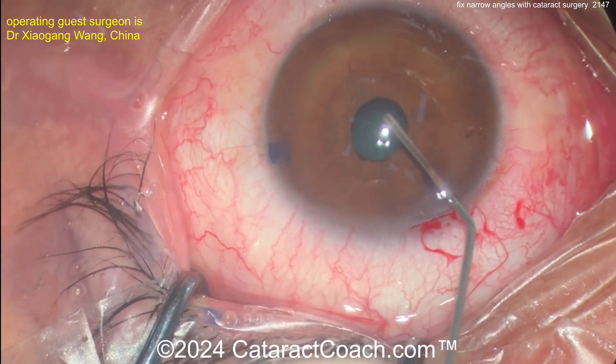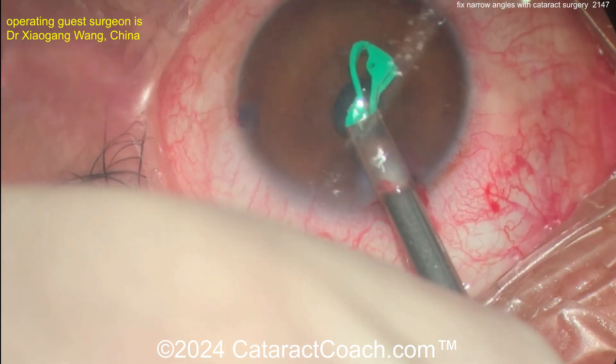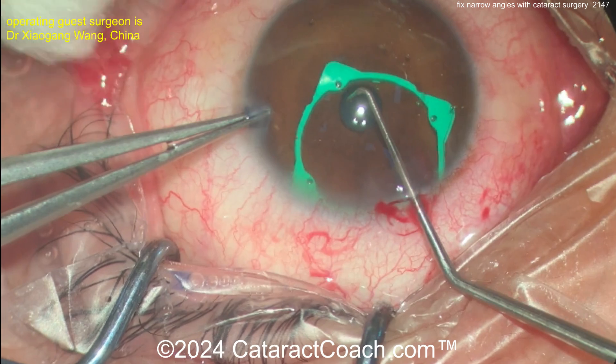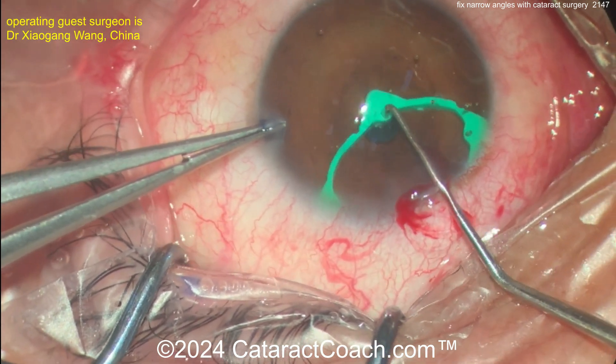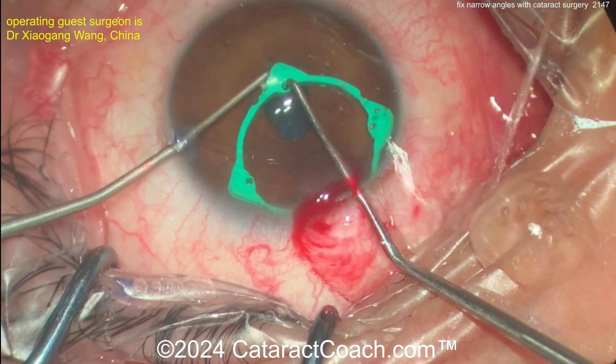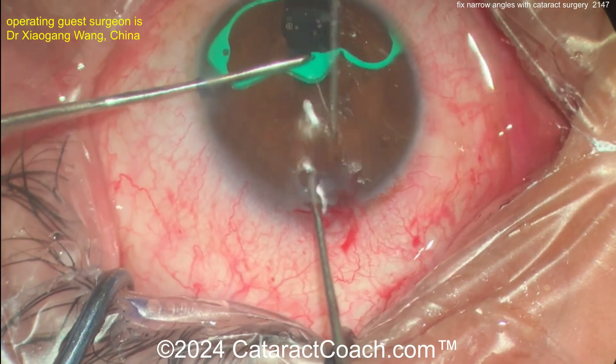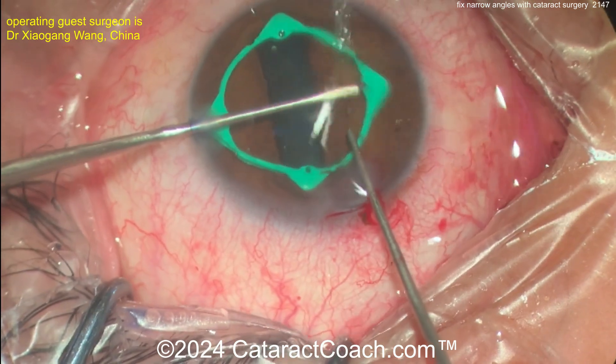Look at this small pupil case — wow, that's really tiny. Here comes a pupil expansion ring, a different design than we normally see. One eyelet is being placed at the pupil margin. This looks like a pretty big and bulky pupil ring, but it can certainly work.